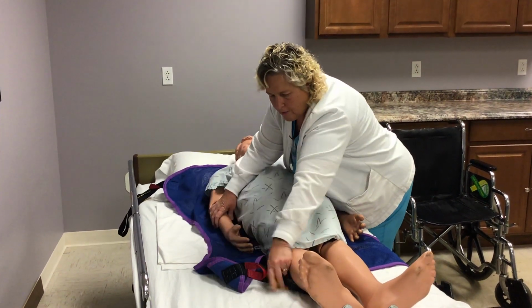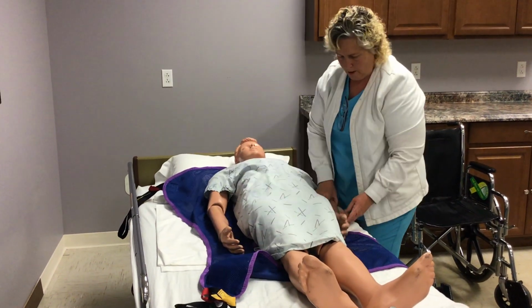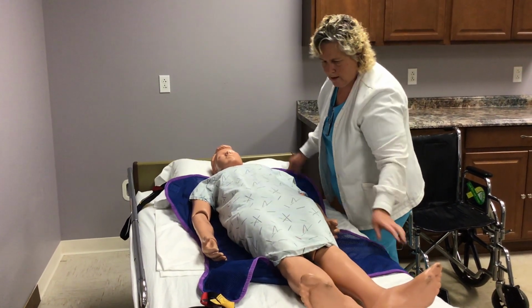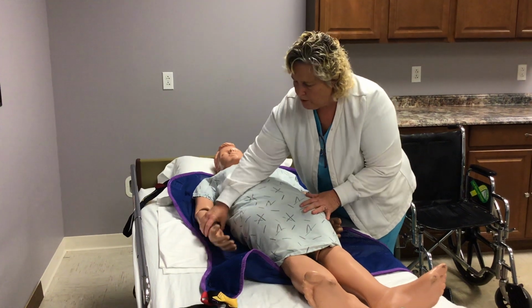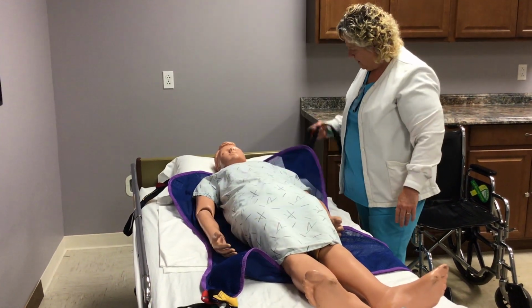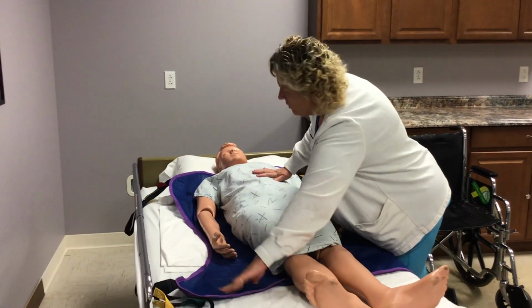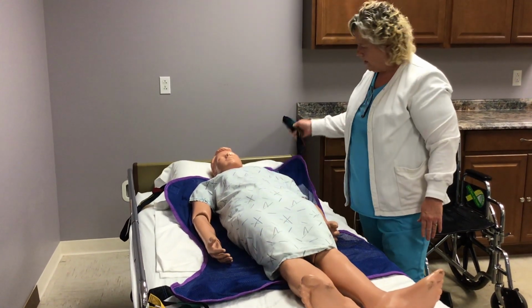Now, on a real person, I would ask them to put their hands across their chest. This mannequin is not going to do that, so I just kind of put them down to the side. Then I make sure that I've got everything laid out and that the straps are ready to go on.